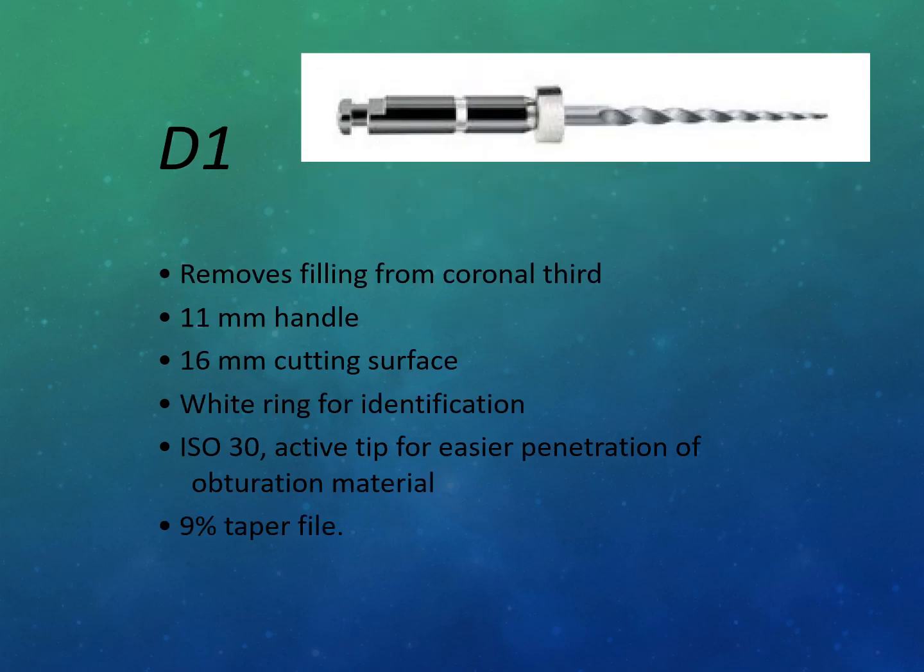Next we talk about retreatment files. We talk about retreatment where you have filled the root canal and there is a short fill of apex, or a patient comes to you from a different clinic where the obturation is not done properly, so you are planning to do a root canal treatment. The normal conventional method is the use of H file and xylene, that is GP solvent, to remove it, whereas that is little time consuming. So a ProTaper system has got retreatment files D1, D2, D3.